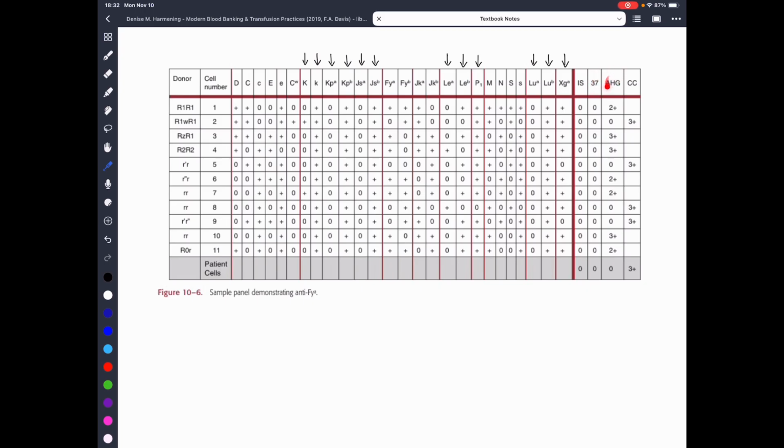And AHG, which chapter 5 is dedicated to, is a reagent that is added to patient serum, and it helps IgG antibodies that didn't create agglutination create agglutination. So it's basically an anti-antibody. So the AHG binds to IgG to allow it to create agglutination, because without it, IgG could bind, but it wouldn't create agglutination because the antibody is too short, or what the book terms as incomplete.